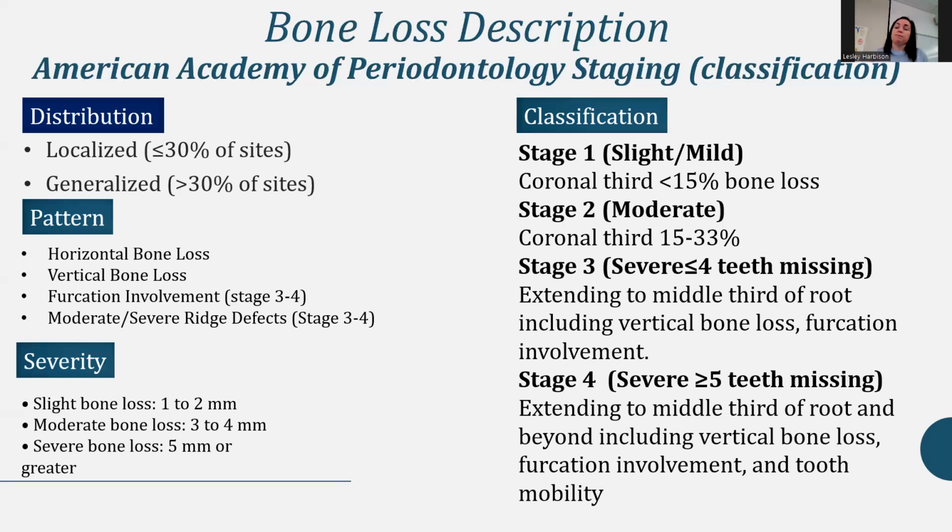So you wouldn't base your stage 1, 2, 3, or 4 off of your measurements alone, but they do play a significant role, because a lot of times it will directly put them in a stage. But you look at other things too. You kind of look at all of it, but start with this stuff first.